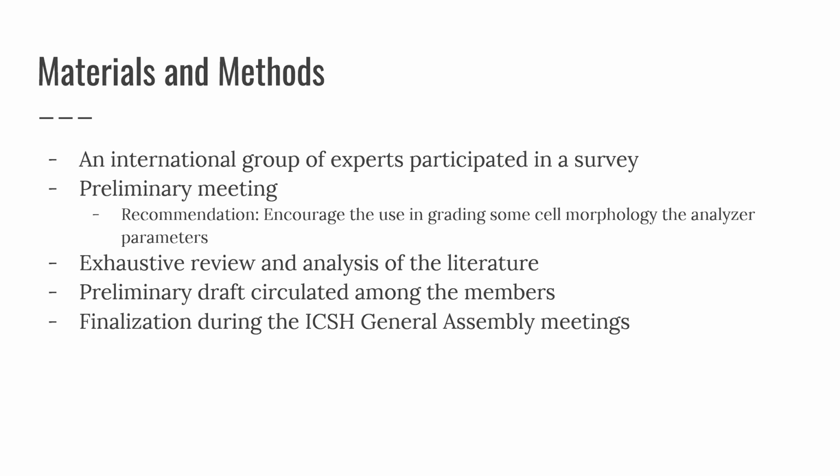After an exhaustive review and analysis of the literature, the preliminary draft was circulated among the members, and it was finalized during the ICSH General Assembly meetings. There were a number of differences in opinion on nomenclature and practice, and so this document reflects a consensus agreement on nomenclature and grading between the members and is intended as a guideline only. It was also agreed upon that a database of the reference images will be provided.